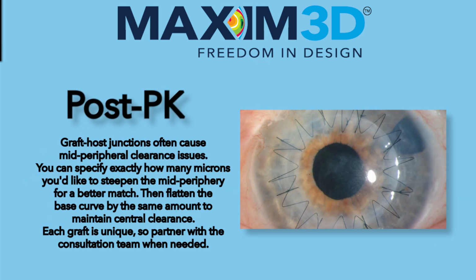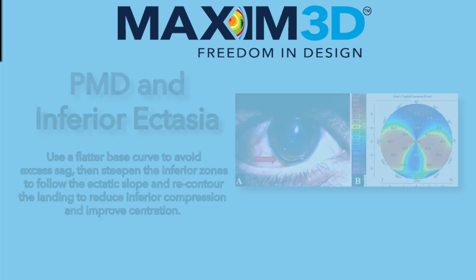Post-PK, graft-host junctions often cause mid-peripheral clearance issues. You can specify exactly how many microns you'd like to steepen the mid-periphery for a better match. Then, flatten the base curve by the same amount to maintain central clearance. Each graft is unique, so partner with the consultation team when needed.